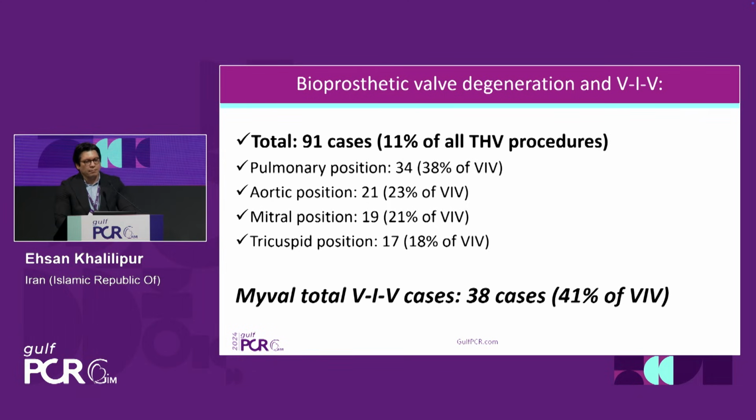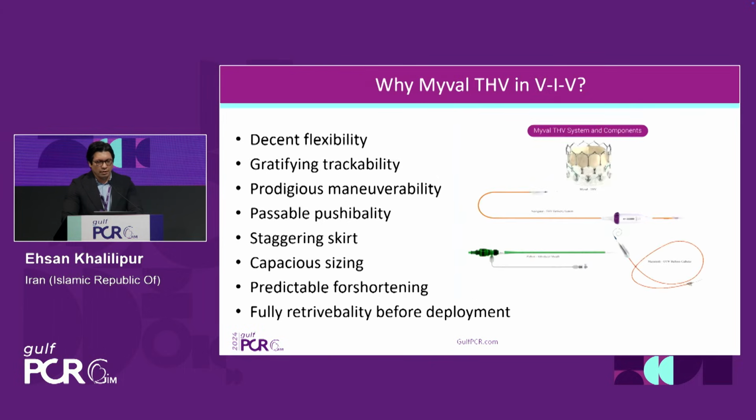In our center, we have performed 91 cases of valve-in-valve with all platforms, most of them in pulmonary position because we are a referral center for TF patients. And we have performed 38 cases of valve-in-valve with Myval, which is 41% of all cases.